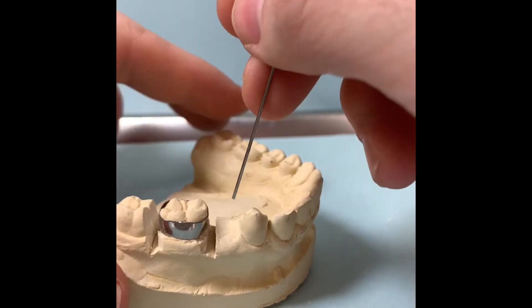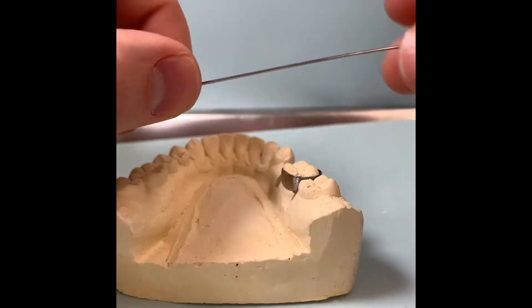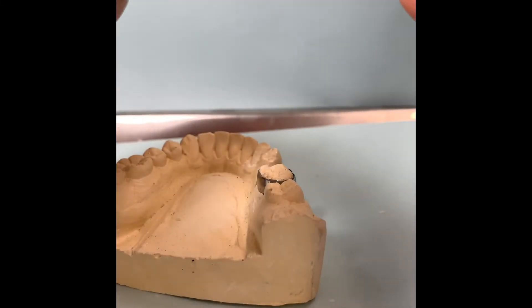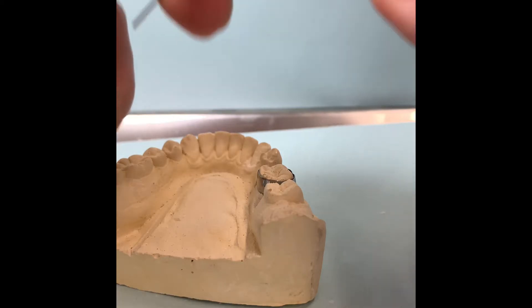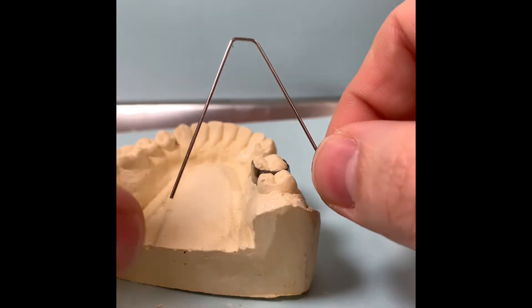If it's not contacting, the teeth can shift. So the best way to go about this, you get the width of the adjacent tooth, and then we do two bends back. It's going to look almost like a little loop.